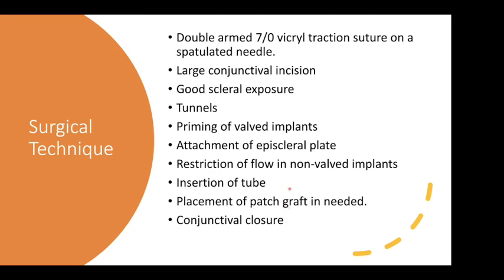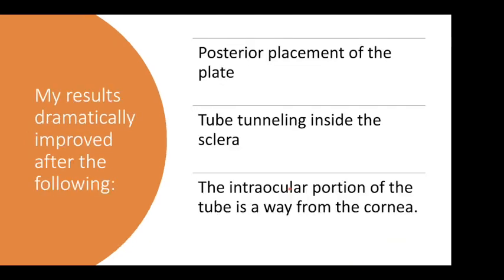Insertion of the tube, and then just coming to the points which I think have shifted my career in this area. What are the secrets behind my great interest in the valves nowadays? First of all, is the posterior placement of the plate. It is technically difficult, but I think it's very rewarding when the plate is very posterior because the Tenon's in the posterior part is very thin. I found this, the Tenon is very thin, that could help the better pressure. So I think that's something good.